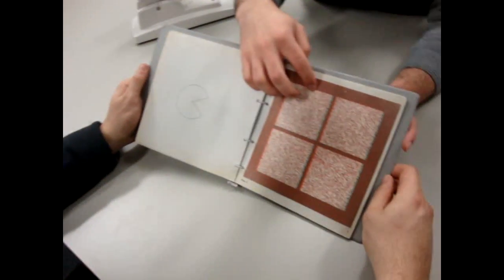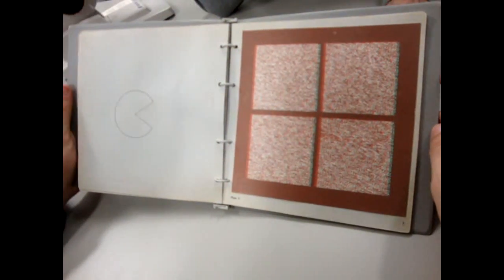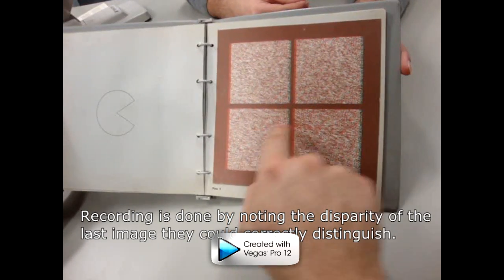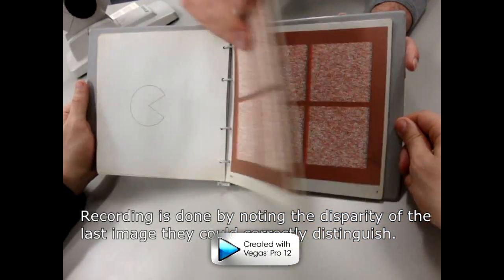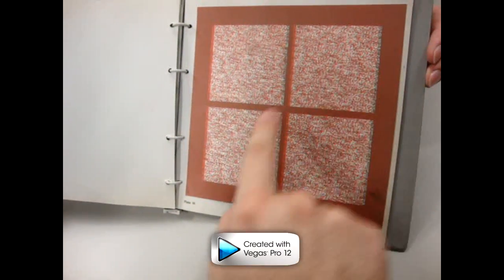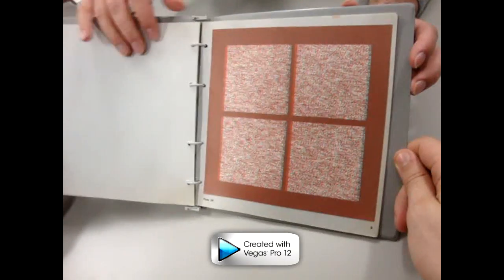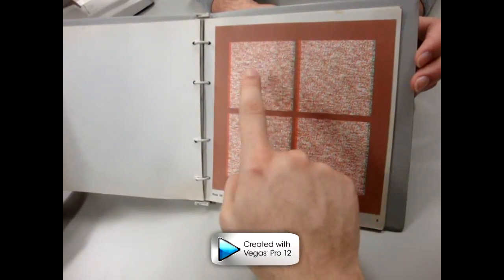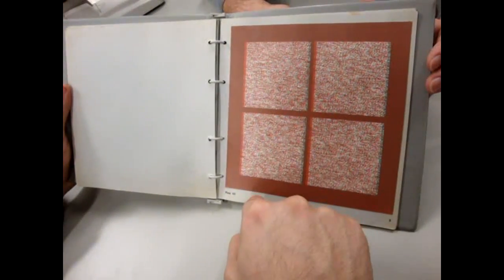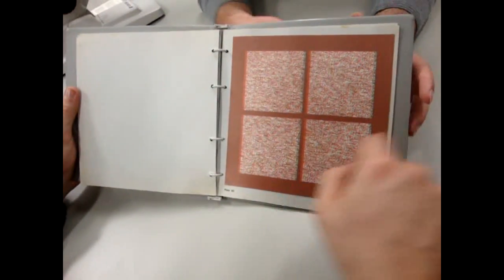Alright, look at that picture there. I want you to look on this page, and in each quadrant identify which position the missing piece is facing. Towards the bottom, left, up, down. That's good. Same as before on a different page. Up, left, right, right. Okay, one more. Bottom, right, and I can't see these two. That's good. Thank you.